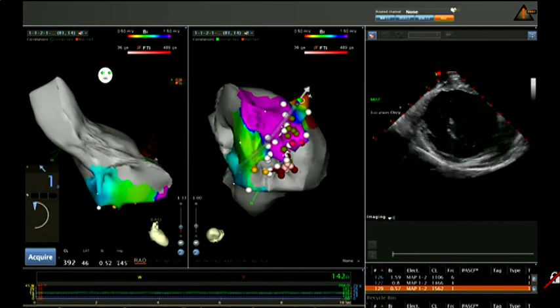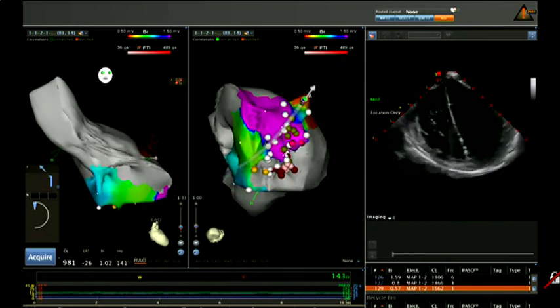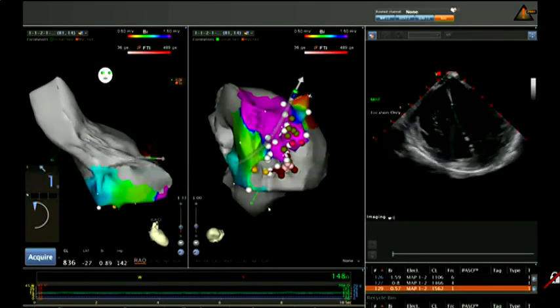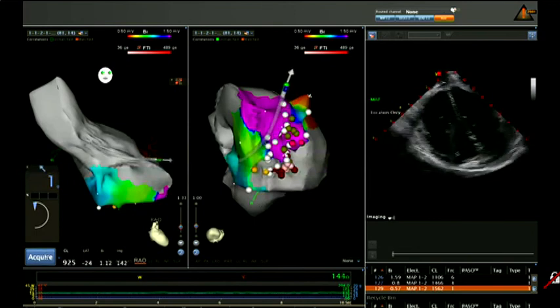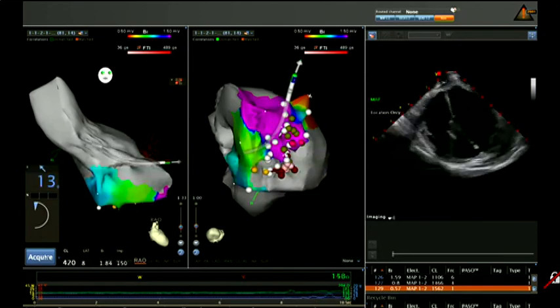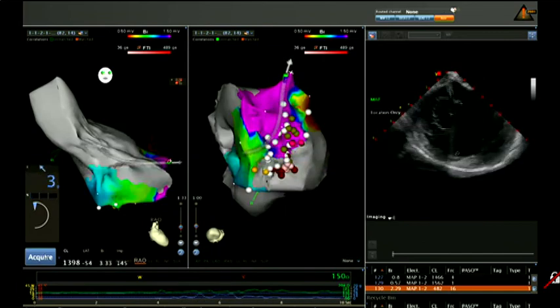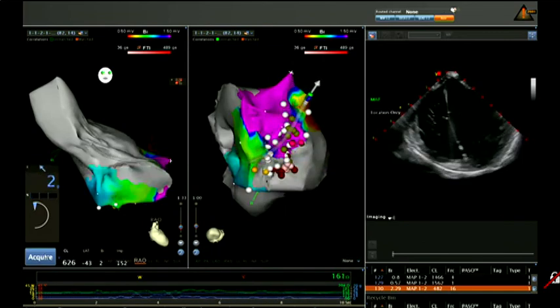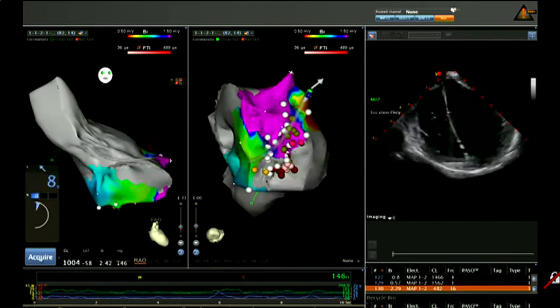That's an important effect, because when we compare with isoproterenol, most of the times looking to induce PVCs, isoproterenol just increases the heart frequency, sometimes producing inhibition of the PVC manifestation. Also, Luis, with isoproterenol, you also get hypotension, whereas with dobutamine you do not. Absolutely right, Andrea.